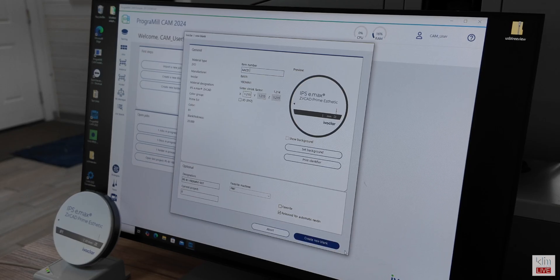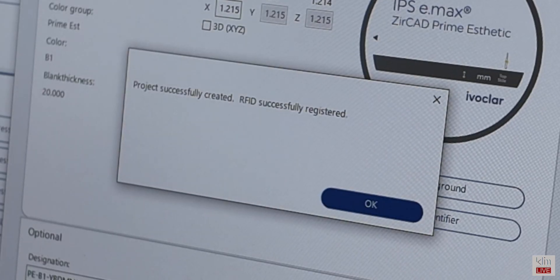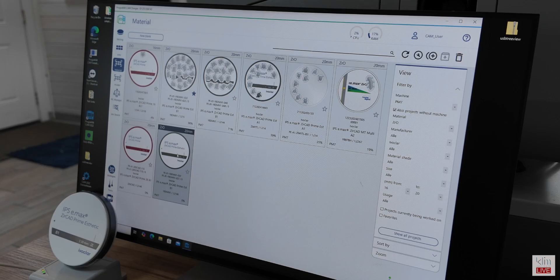The RFID label provides efficient registering of that disk within the CAM software for the PM7. By simply placing the disk with the RFID reading strip onto the RFID reader, it will automatically initiate the CAM software to read that disk. Once that disk is read and it's in the CAM software, we can retrieve it later on.